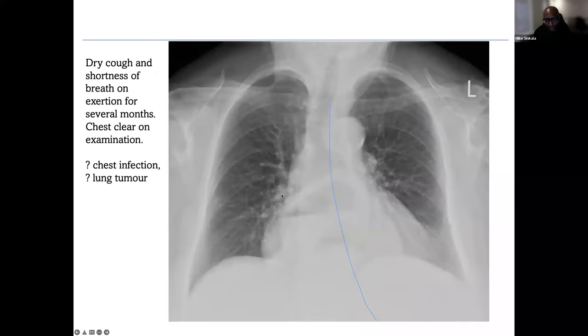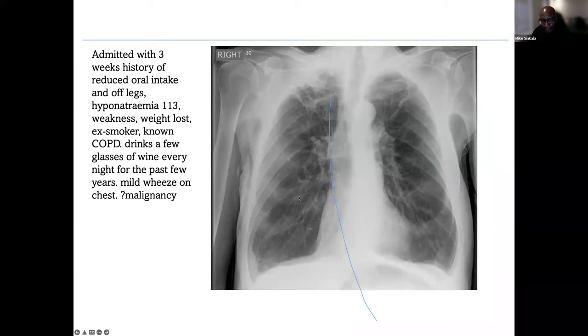Yeah. So this is just the hiatus hernia. We do have the stomach right into the chest here with an air fluid level here. So hiatus hernia, again, remember, it may cause widening of the subcarinal angle here. So yeah, this is just the hiatus hernia here.